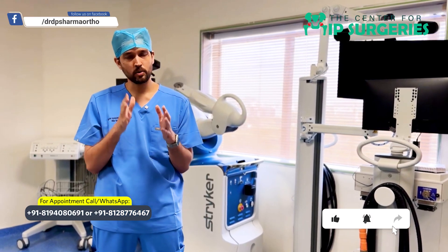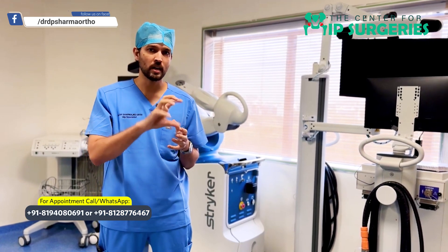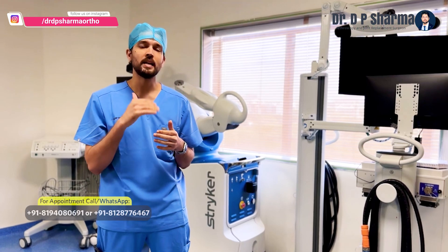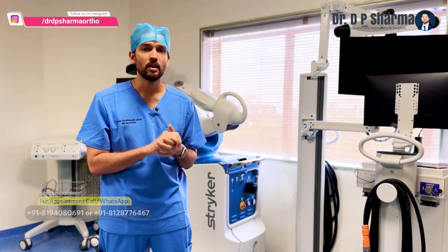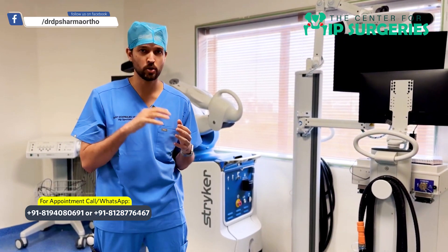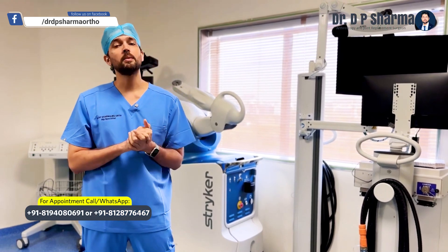The robot then does a single ream, so the reaming is not sequential. This is another big advantage — because reaming is done only once, the blood loss is less, the pain is less, the soft tissue release is less, and you always get a perfect acetabulum fit. You can check all of this before the surgery, so you don't have to go inside and check during the procedure.